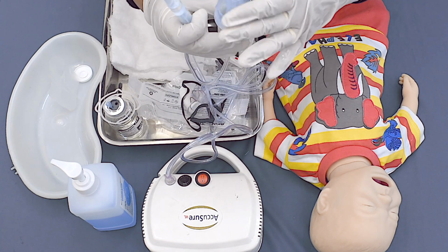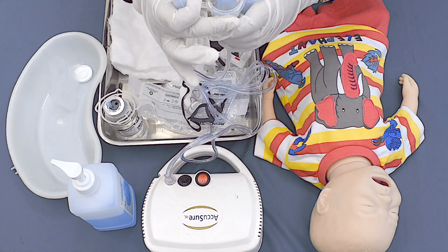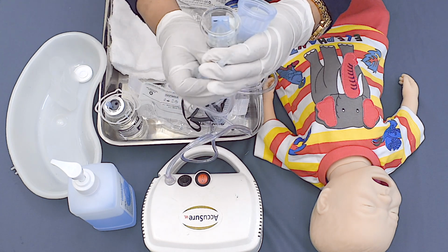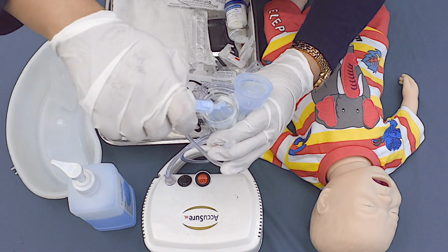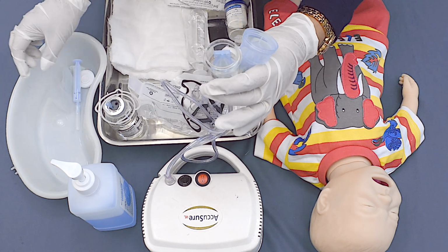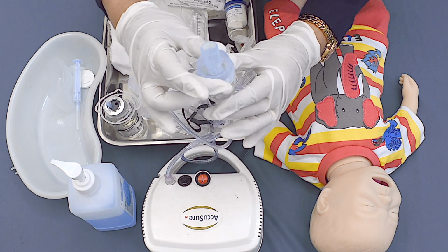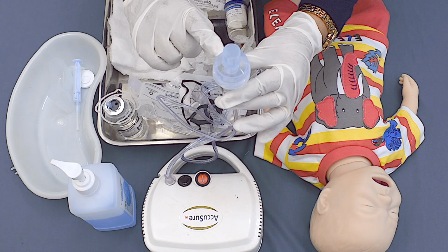The kit has to be opened. Do not touch the inside of the kit. Pour the required amount of medication in the kit and close the kit. If the medication is to be diluted along with normal saline, the normal saline has to be poured right in.